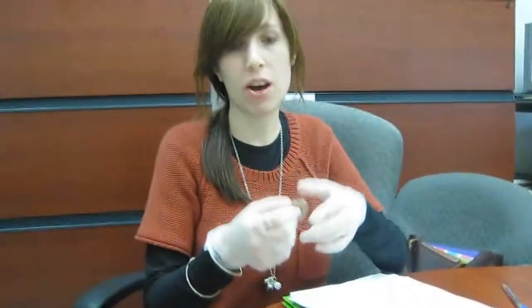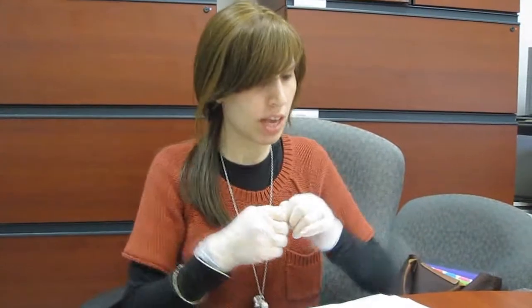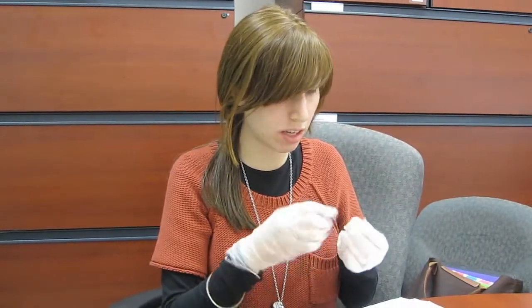Hi, we're performing a visual inspection of a behind the ear hearing aid. We're going to check this, just brush it off, make sure it's clean. We're checking if there's debris or wax, so we're just going to clean this out over here. Use this to clean this out.